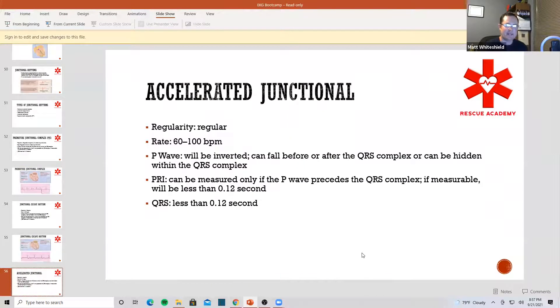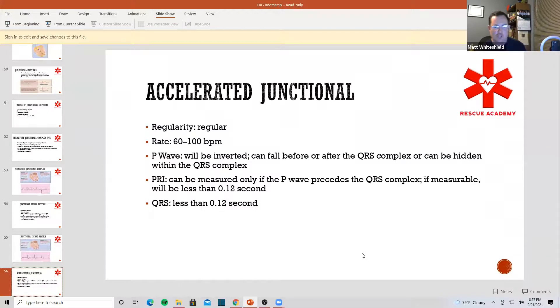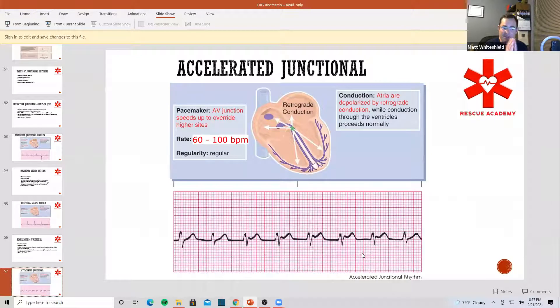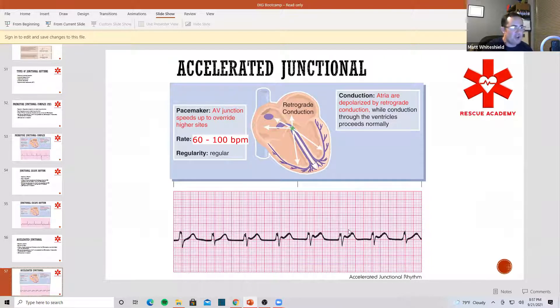Let's talk about accelerated junctional. Accelerated junctional is the same rate as a normal sinus rhythm — 60 to 100 is considered accelerated junctional. So basically this is going to look like a normal sinus rhythm but with no P-waves, or the P-waves are just going to be flipped upside down. We have narrow QRS complexes and notice there are no P-waves in between.